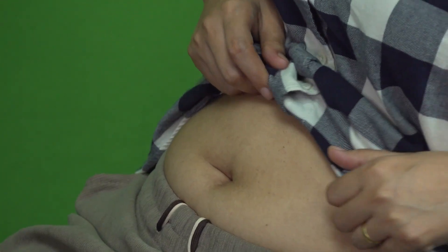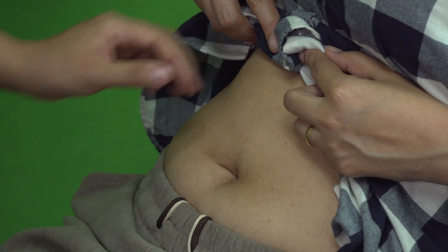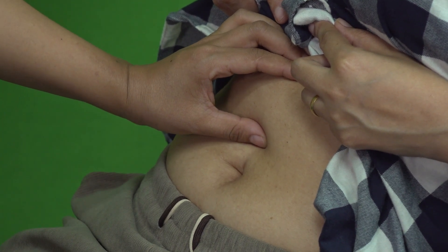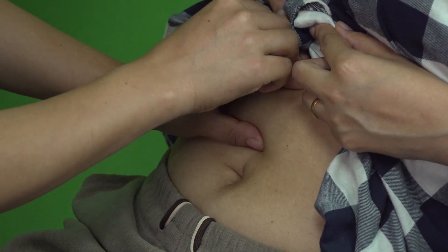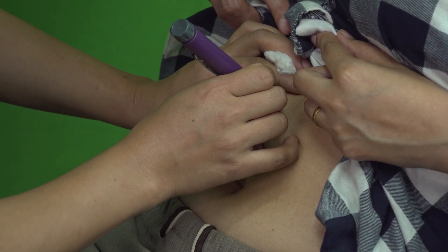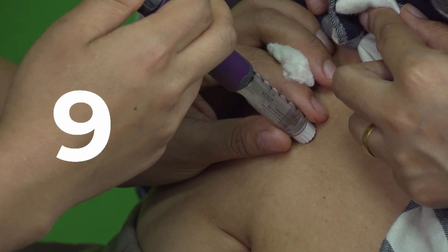For administration, choose an appropriate injection site, ensuring proper site rotation to prevent skin complications. Pinch the skin gently and inject at least two inches away from the navel. Clean the site and inject the insulin by pressing the button fully until it reaches zero, then hold for 10 seconds to ensure complete delivery.